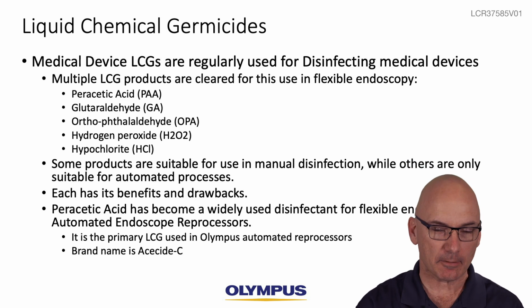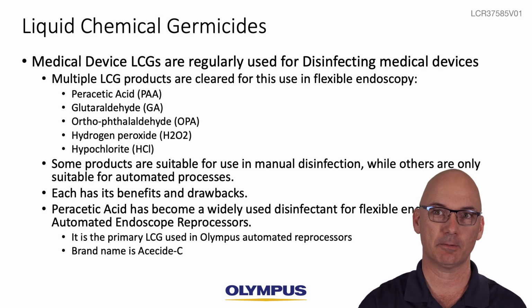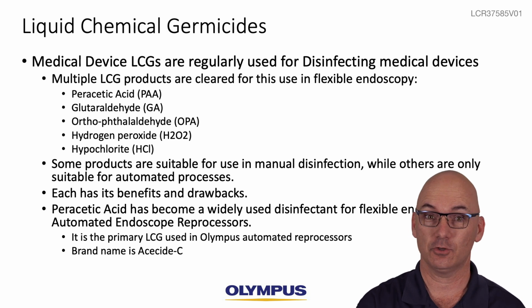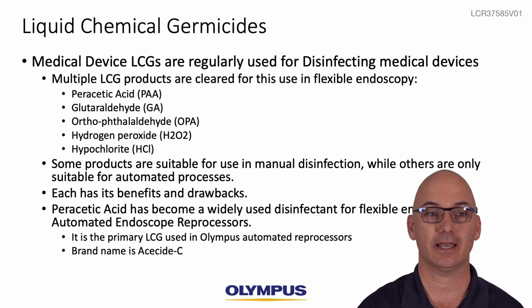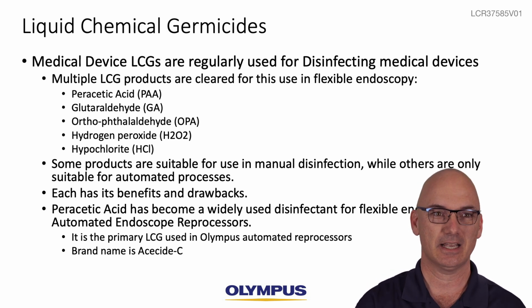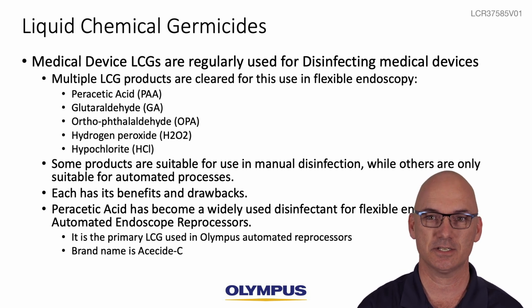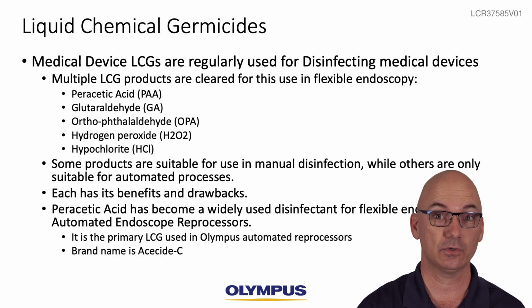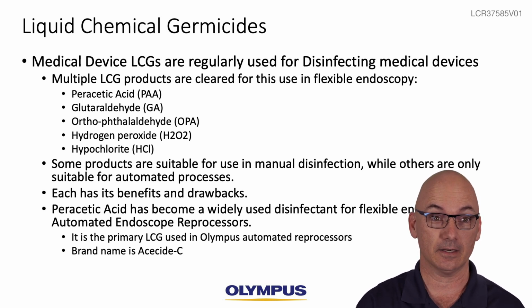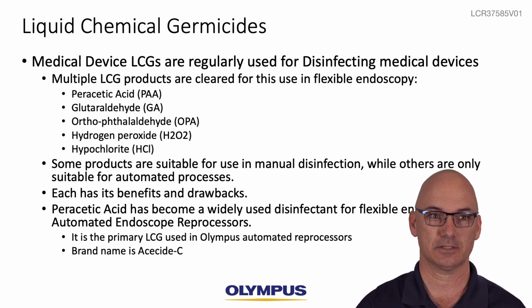So I've mentioned liquid chemical germicides a few times, and how medical devices are regularly disinfected using liquid chemical germicides. There are multiple products out there. You may see peracetic acid, you may see glutaraldehyde. Orthophthalaldehyde, commonly called OPA, is regularly used, as well as hydrogen peroxide and hypochlorites. These all have their pluses and minuses, their pros and cons. Some are useful in manual disinfection, others are for automated reprocessing only, and only suitable for AERs. Each has its benefits and drawbacks.